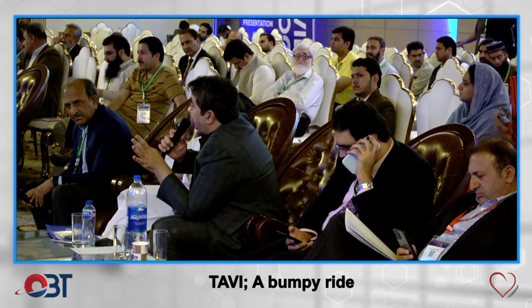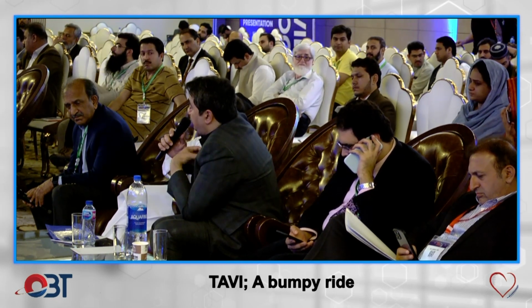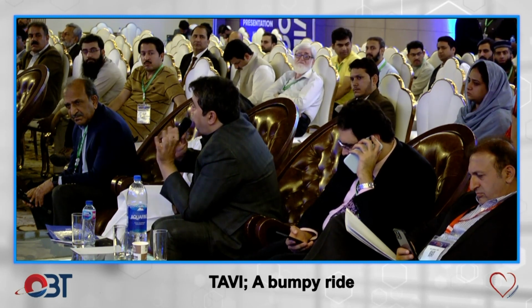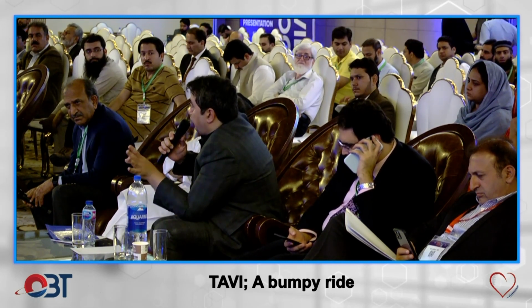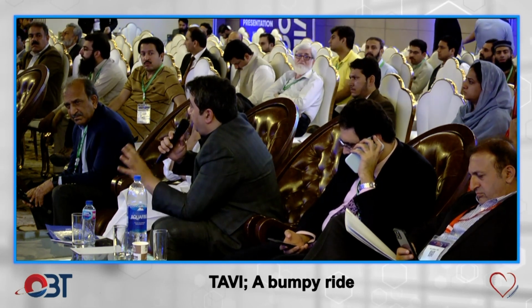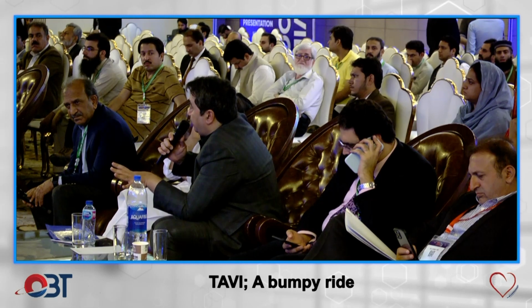The second thing is this, my suggestion is that I wouldn't upgrade the balloon, because you cannot open this raphe. This raphe is not going to open, so whatever ballooning you did, just be happy with it. You have made the space, and go with the stent after that.